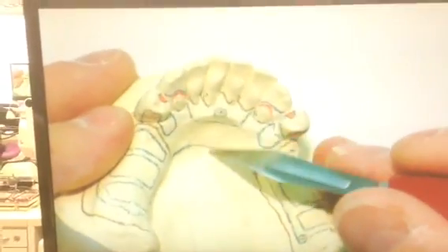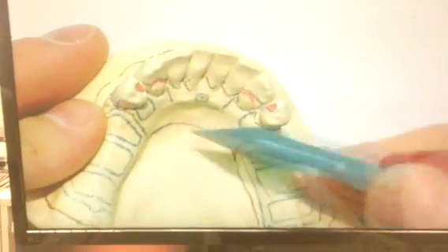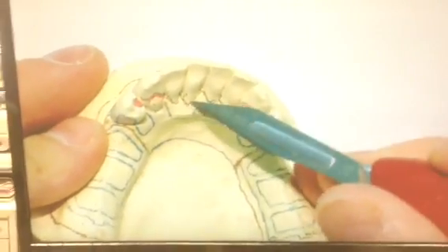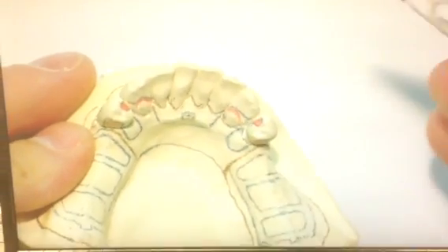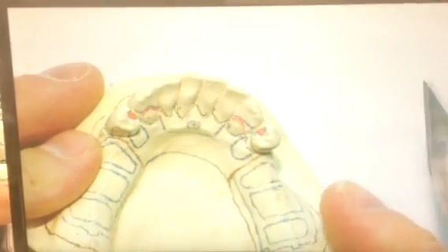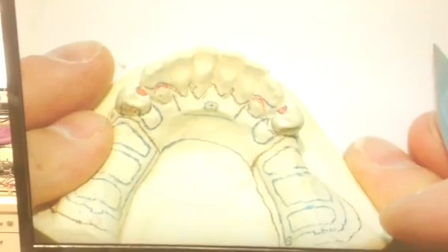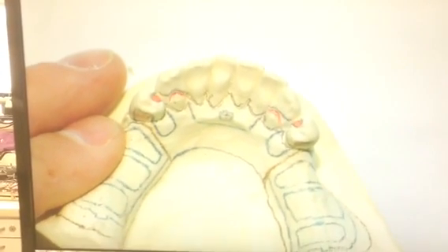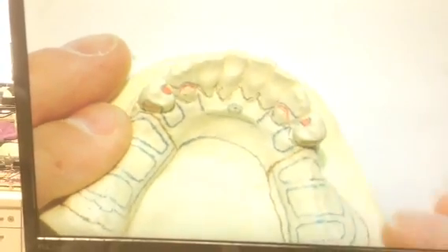They used a lingual bar. There's nothing wrong with it. It's not contraindicated in this case, as long as you could stay off the free gingival margin and keep your bar the right width. My argument is on the test, plate it. Why worry about following all the rules? If you plate it, you don't really have any rules other than to scallop the top edge and stay above the frenum. I like that idea.